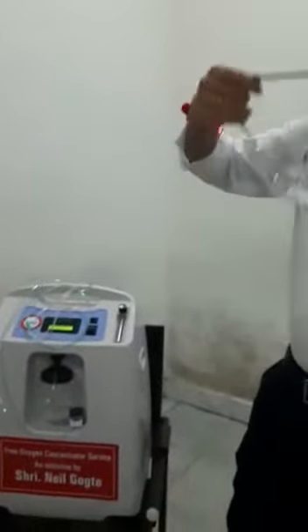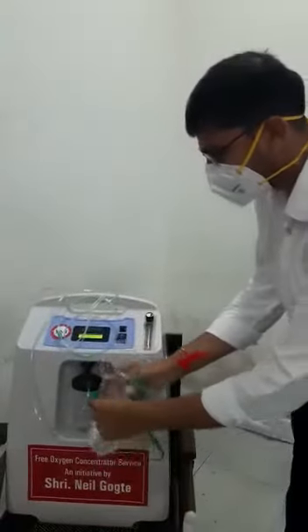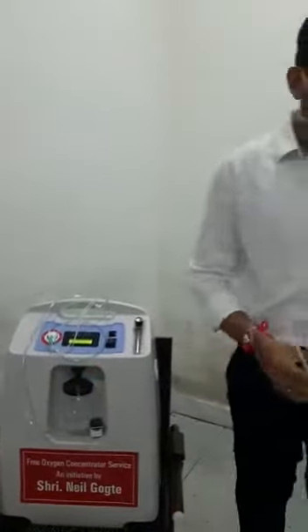So you have to remove the cannula and put this mask on the patient like this. The oxygen wire goes in here — you remove it from the cannula and put it into the mask. This is how you are supposed to use it.